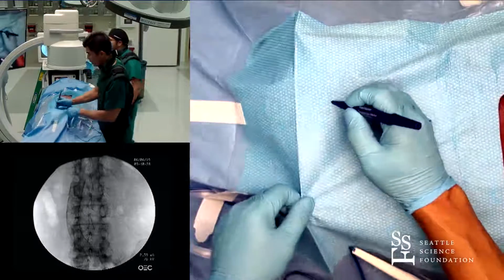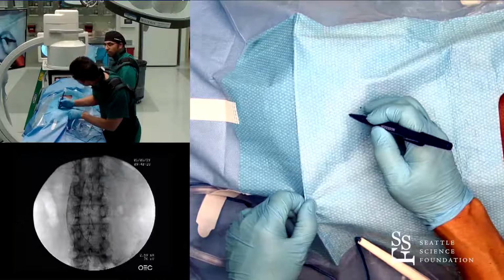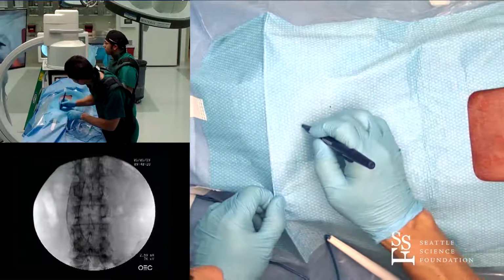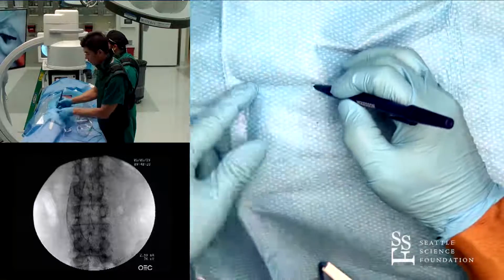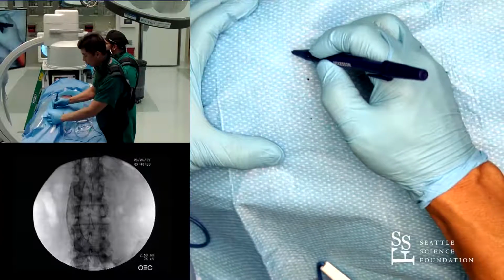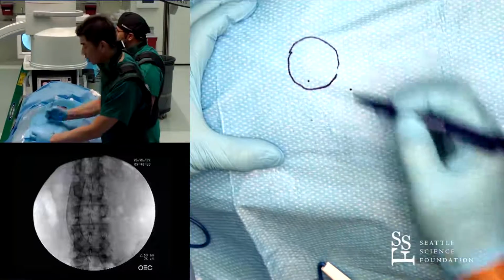Okay, so I'm just gonna show you what we're trying to do. Let me just see what that looks like. So this is the spinal column. Obviously we have a vertebral body and I wanna show you what we're doing. So here's a vertebral body, and this is what we call the axial view.